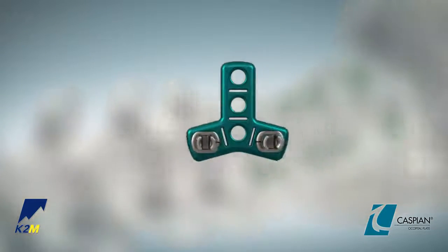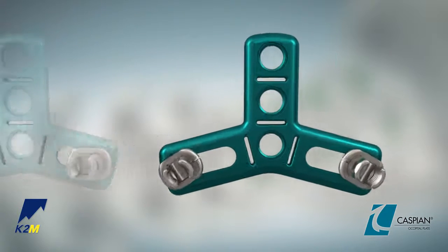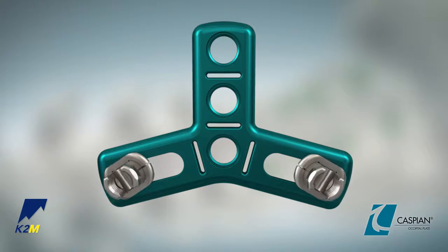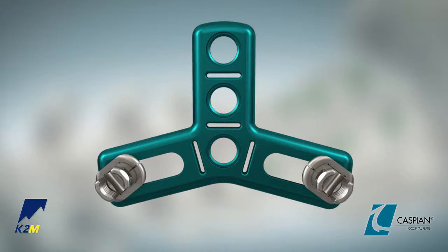The Caspian Occipital Plates are offered in three sizes: 30, 40 and 50 millimeters. Each plate allows the lateral adjustable screw heads on the wings of the plate to slide medial-lateral from a minimum rod-to-rod distance of 25 millimeters to a maximum of 30, 40 or 50 millimeters respectively.